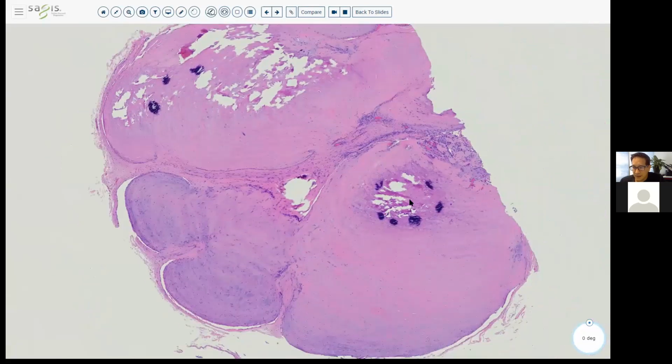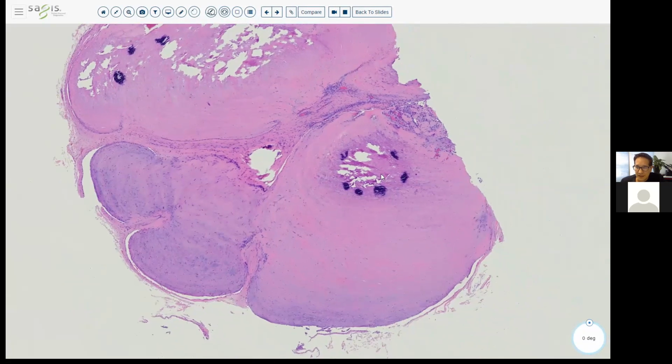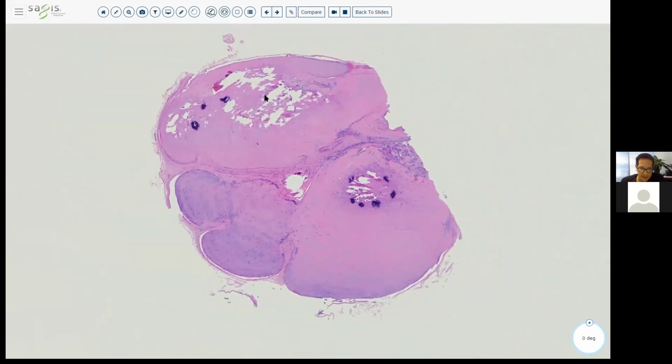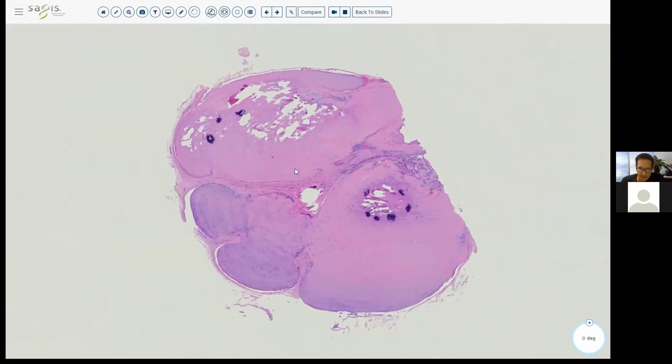Again, don't be alarmed by the necrosis, which you often attribute to malignant. In this case, the lesion is not malignant, but can have some necrosis and some calcification. But myofibroma, you can stain this. They will be SMA positive, but they should be negative for S100, pancytokeratin, and desmin. So SMA positive. Myofibroma. Next case.